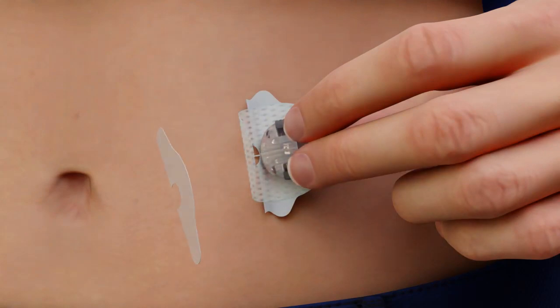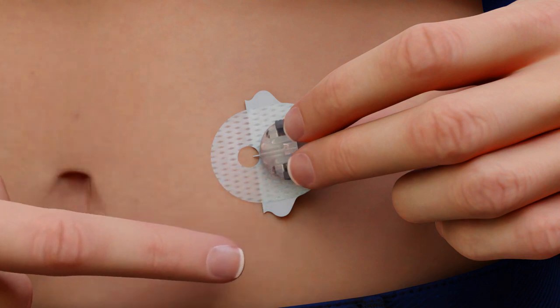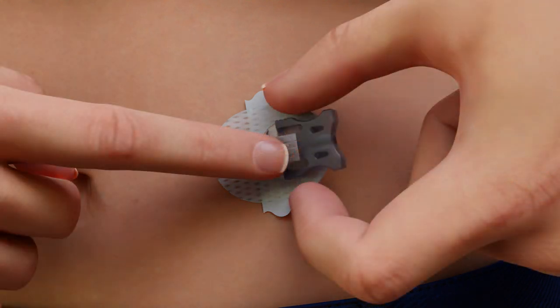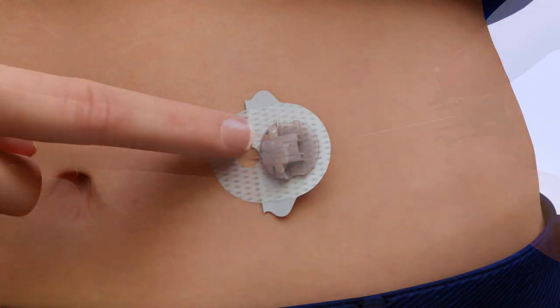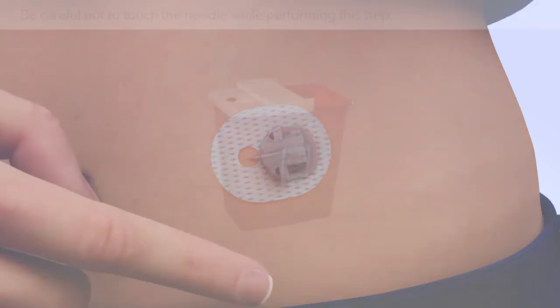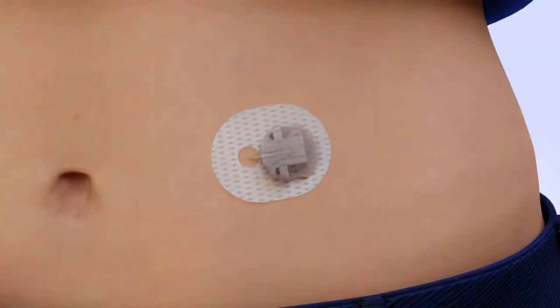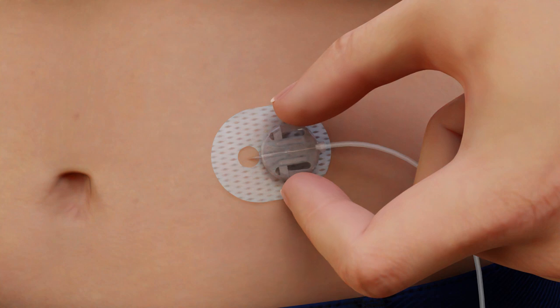Holding the cannula housing with one hand, remove the front paper backing and smooth the adhesive securely to the skin. Place a finger on the front portion of the cannula housing. With the other hand, squeeze the gray arms and pull back to remove the introducer needle. While keeping the set secure, gently remove the remaining paper backing and smooth to skin. Dispose of the introducer needle into a sharps container. Now connect the infusion set tubing to the cannula housing by sliding the connector directly into the cannula housing until you hear an audible click.